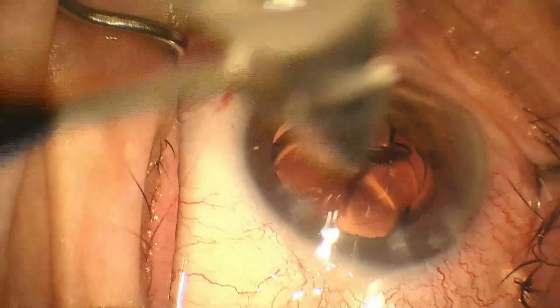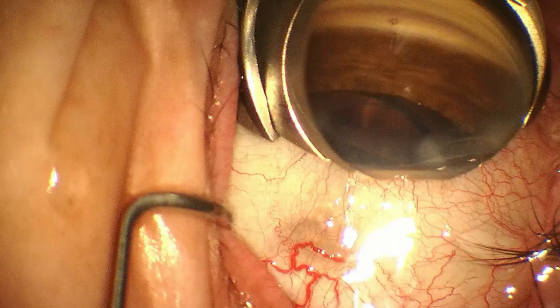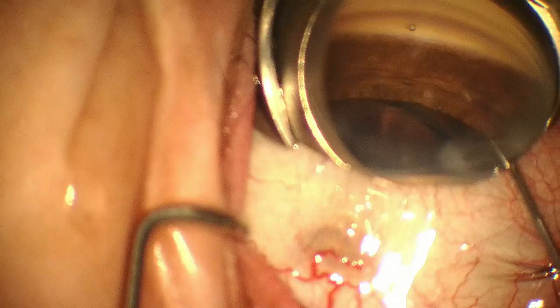The slim profile is designed to fit within most eye lids and orbits. The fixation surface on the lower aspect of the ring is designed to allow the surgeon to fixate and position the eye for visualization, minimizing the need for patient cooperation.